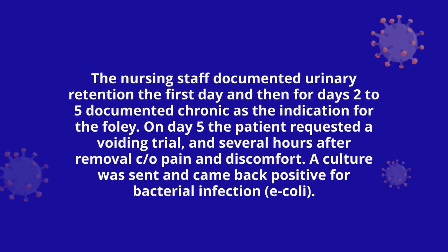The nursing staff documented urinary retention for the first day, and then for days 2 to 5 documented chronic as the indication for the Foley. On day 5, the patient requested a voiding trial, and several hours after removal complained of pain and discomfort. A culture was sent and came back positive for a bacterial infection.